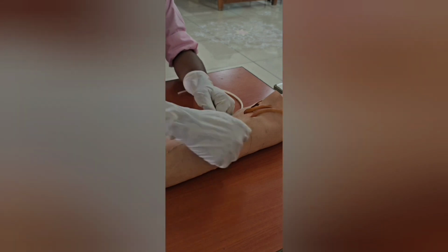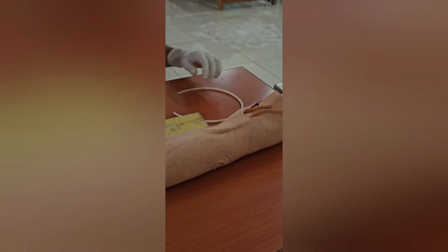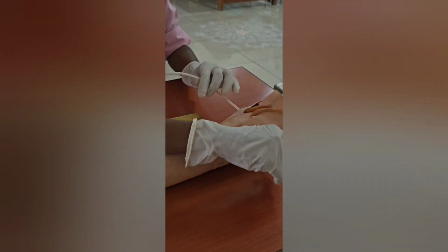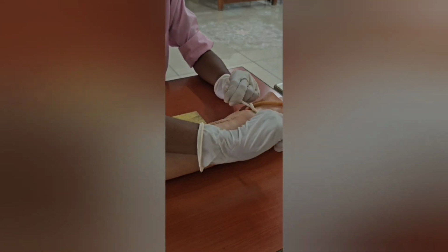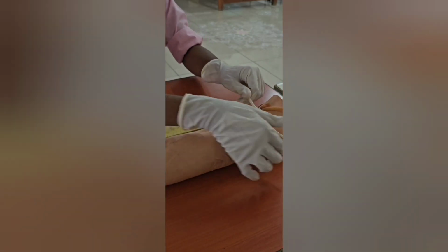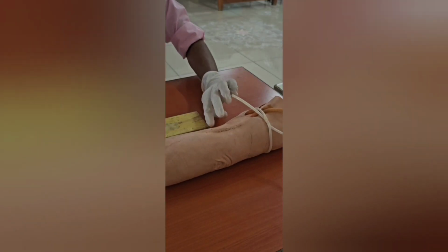Before starting any procedure, wash your hands, explain the procedure to the patient and get their consent and reassure them if necessary. Once that is done, uncover the area to be injected completely. We should tie the tourniquet above the area to be injected. In this case, since we are using the median cubital vein, we will be tying the tourniquet in the area above the cubital fossa. Look for suitable vein.